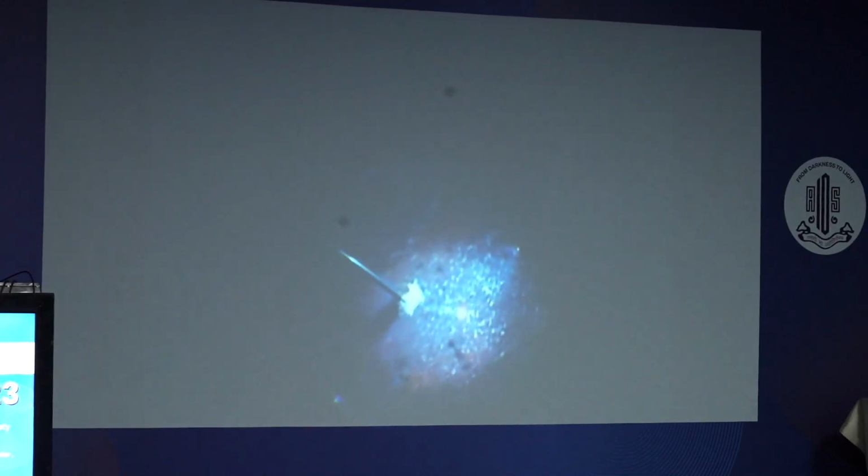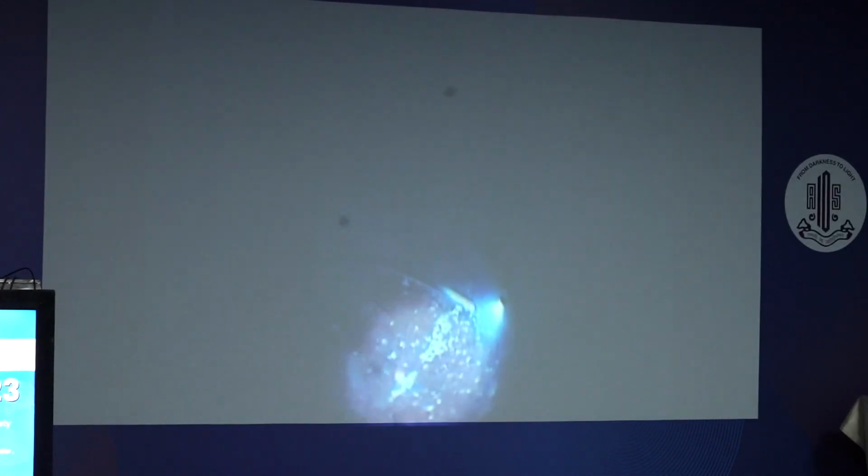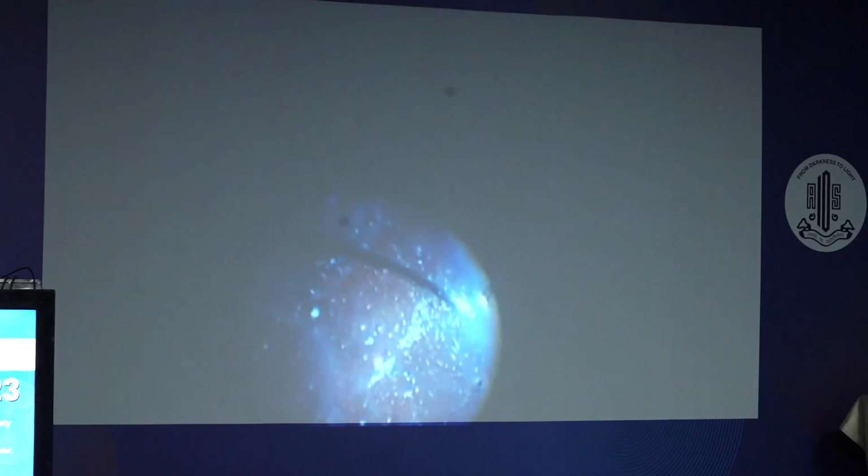Trimmed the area next to the peripheral lesions. Did the trimming up to the ora. Couldn't do a PVD up to the ora.